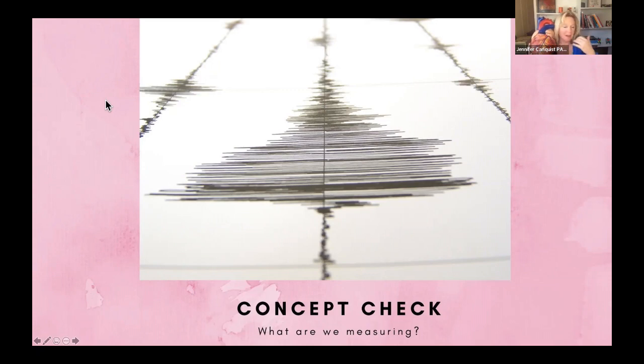So the sinus node, I'm going to show you a graphic. There are 2 ways I like to think about the sinus node, but basically the sinus node is the president of the heart. The sinus node makes the P wave and sends the impulse down to the ventricles. We're looking for a P wave to see if the sinus node is in charge. We're also looking at the way the electricity moves down through the bundles, looking at the width of the QRS. The other thing we're always looking at is how big the voltage is. That's more of a 12 lead thing, which we will definitely go over in our 12 lead classes if you're in the 5-day EKG challenge. But remembering that is basically the concept we're looking at is really helpful.